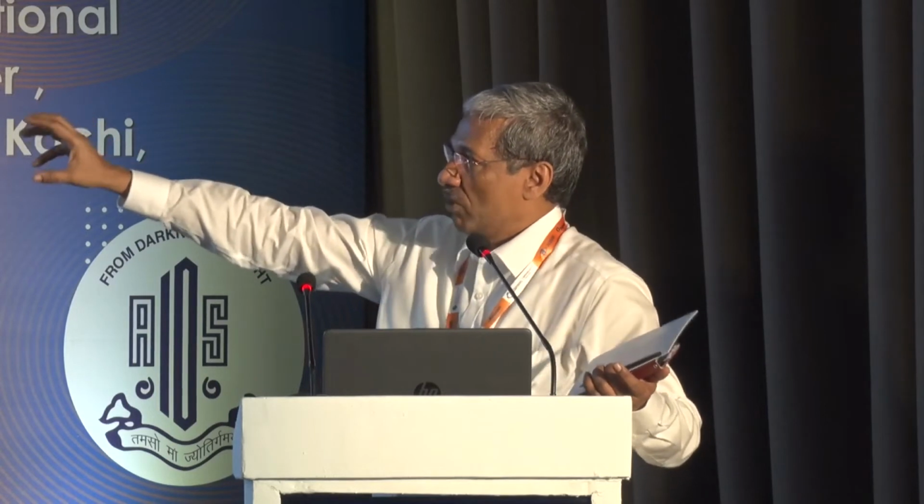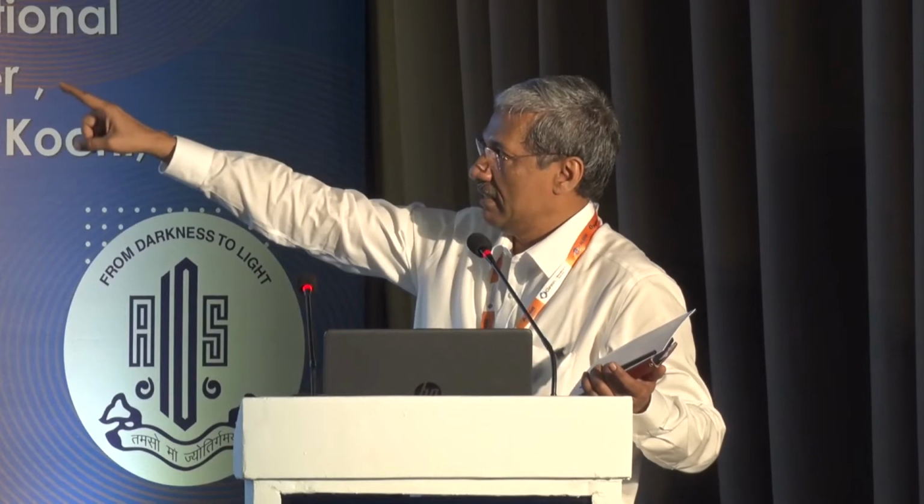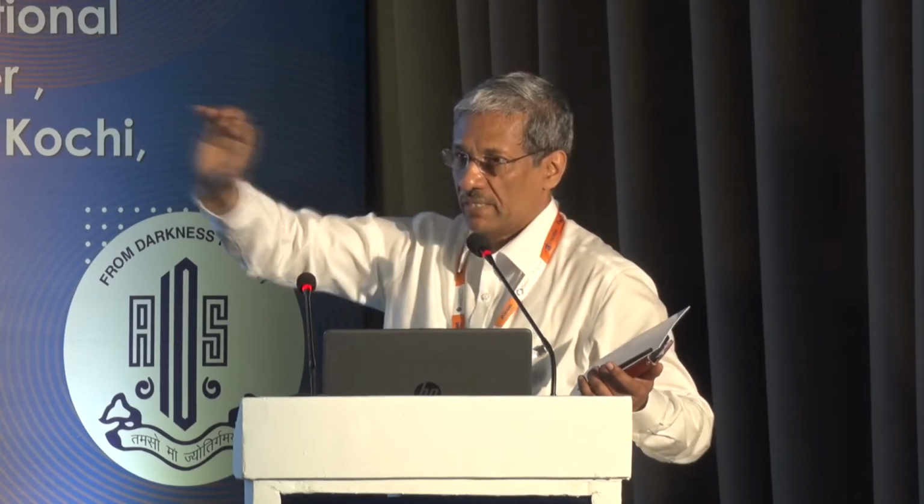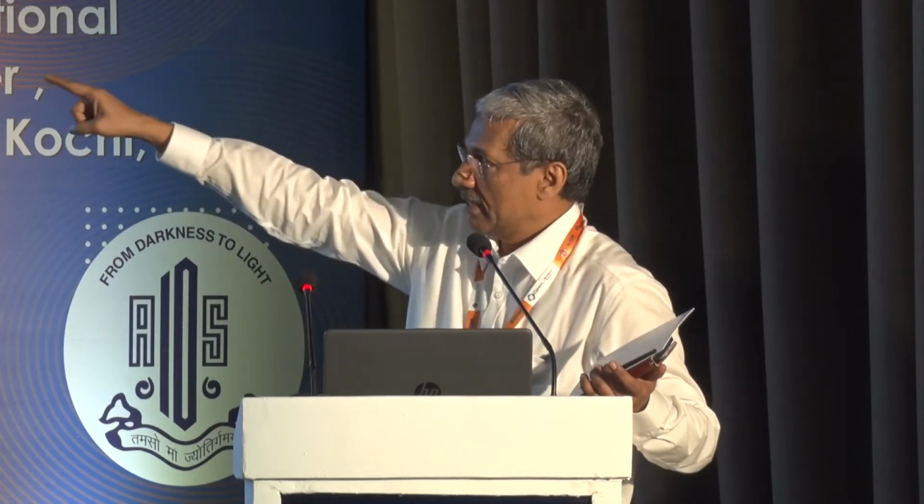So you have 3 rings of 18 points. Each of those rings consists only of 6 points. And what the machine does is it divides each of those rings into 3 zones, the red, the yellow, and the green, just for the color difference. The red zone is actually data derived from one circular point, extrapolated into 3 subzones. Yellow is one circular telecentric point, one circle divided into 3. The software is guessing all this. So it builds it up into 9 zones.